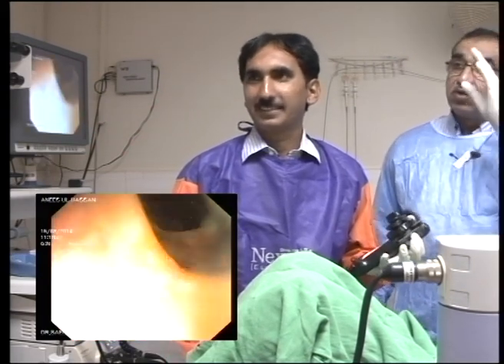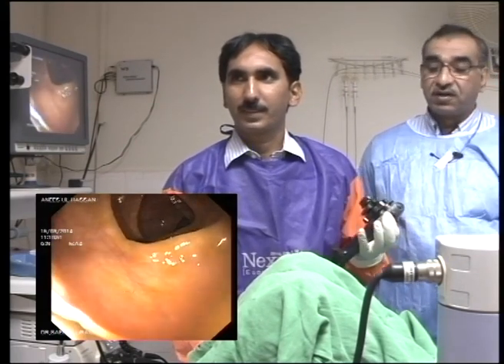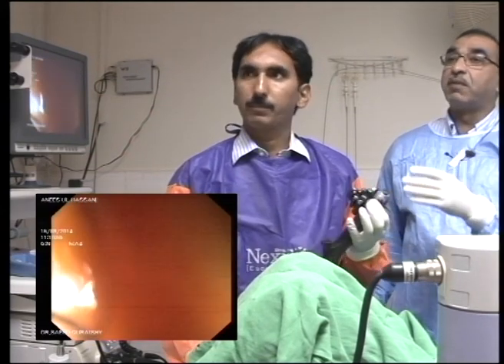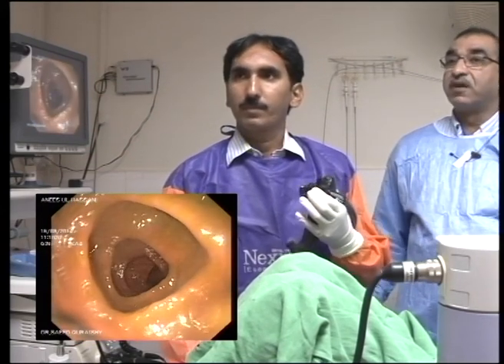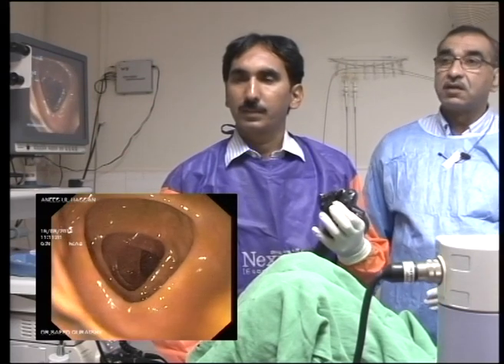At this time you don't need to inflate even a single milliliter of air. It's very inflated, so don't make the procedure harder, because the more air you inflate, the more complicated it becomes for you. The colon becomes bigger and bigger. Okay, now go ahead. Don't inflate anything. Advance.